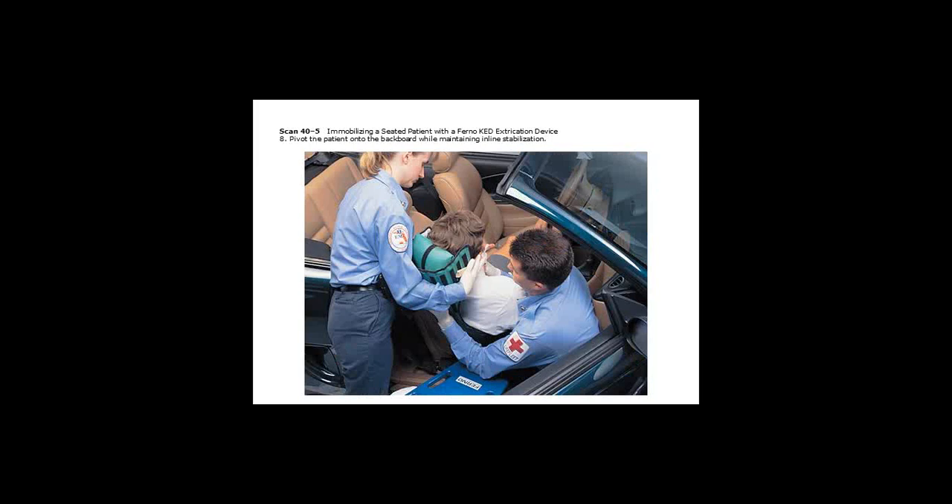They did not show putting the top strap on in this image, but put the top strap on. Then reassess the security of all of those straps, making sure they're good and tight. Rotate the patient — the person at the head still holding onto the head — and pivot the patient in their seat.